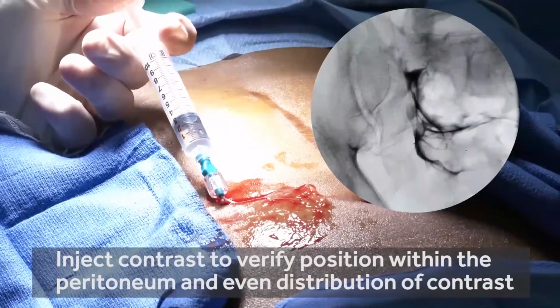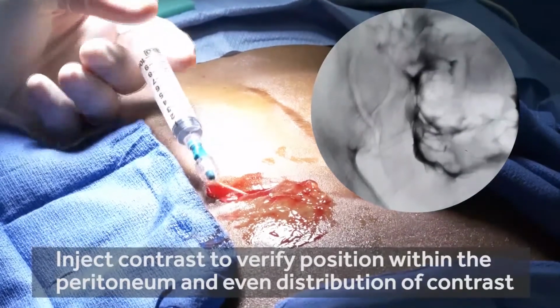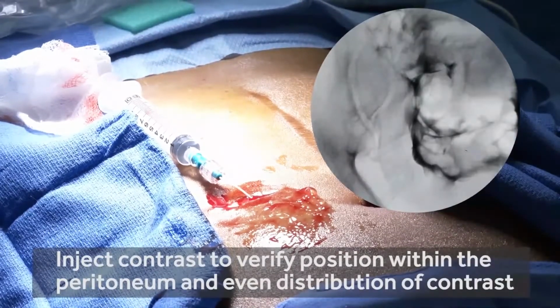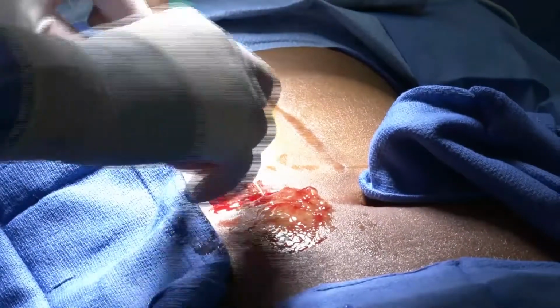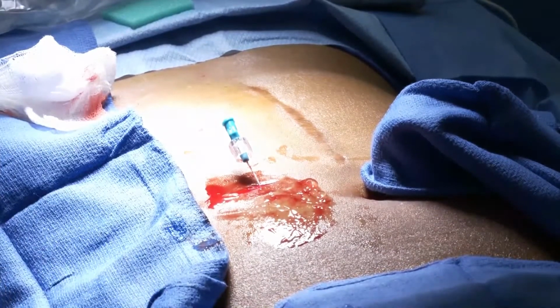If the contrast stays at the tip of the dilator, you know that you are not in the correct position, that you're probably in the muscular wall, and you'll want to restart and repuncture. But here you can see the contrast nicely outlines the small bowel. And there's a good distribution to both the right and the left side of the abdomen.